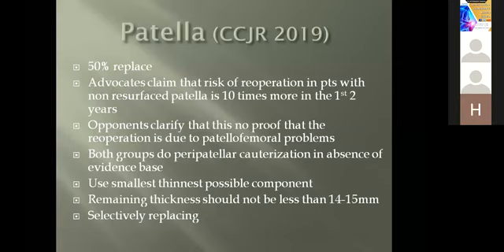Advocates of patellar resurfacing claim that the risk of reoperation in patients with non-resurfaced patella is 10 times more in the first 2 years because of the anterior knee pain. Opponents clarify that this is not proof that the reoperation is due to patellofemoral problems, but may be due to problems other than that, mainly the rotation and the correction of the synovitis.